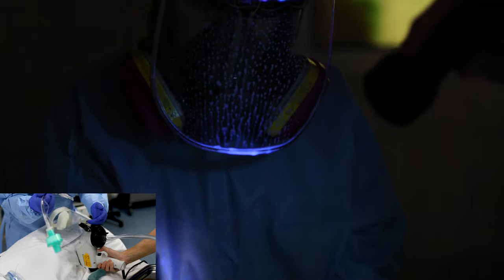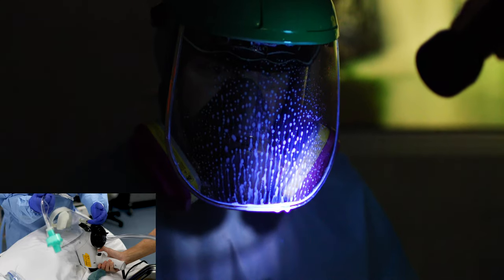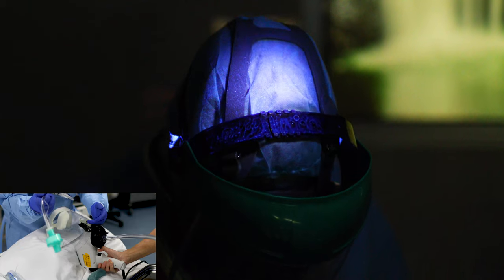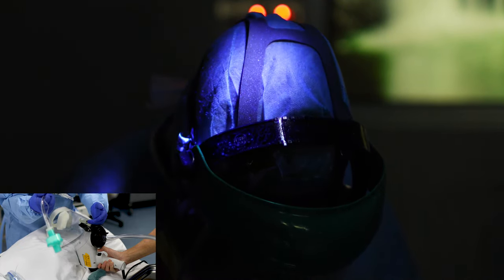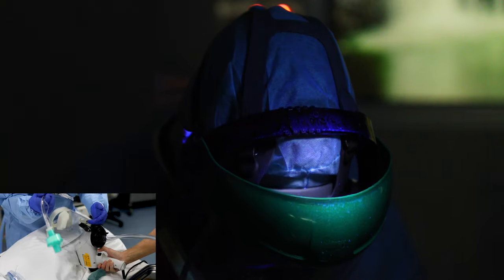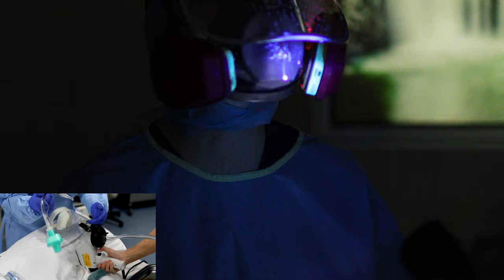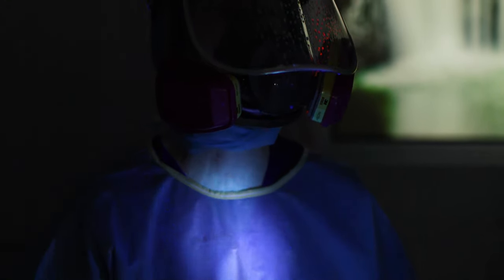We ran the tests twice with a half-second burst to approximate coughing and a 3-second burst to determine a worst-case scenario. Contamination was the same in both burst durations, so except when noted, I'm only using the results of this 3-second burst. In an unprotected laryngoscopy, there was contamination of my hands, torso and shoulders, and gross contamination of my face shield, head, and lower part of my respirator.